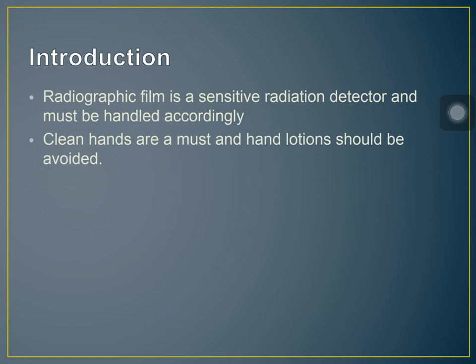And we don't want that. Ayaw natin na may mga thumb marks, may fingerprints yung film natin, because that is considered as a handling artifact on the radiograph. Kaya, hand lotions should be avoided. Okay lang na maghugas ng kamay before handling a film, but wag maglalagay ng hand lotions.